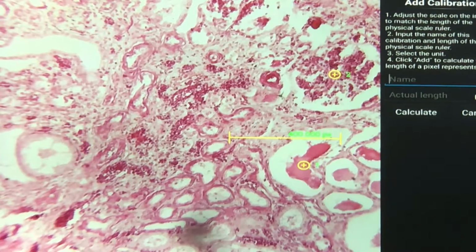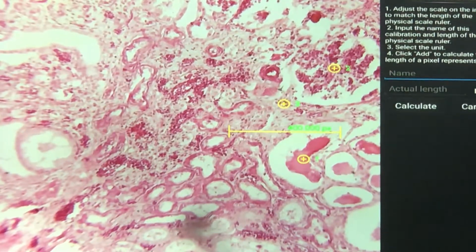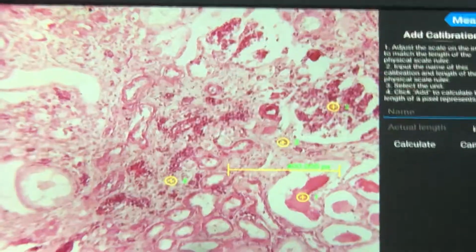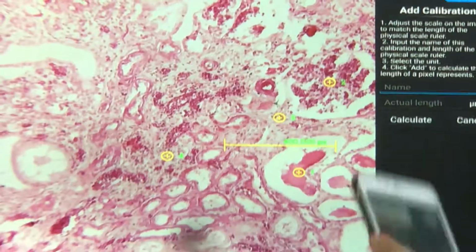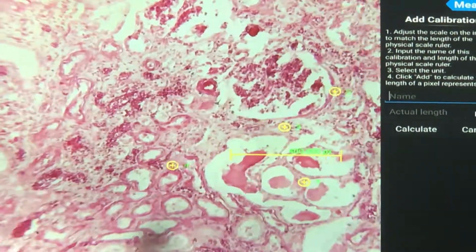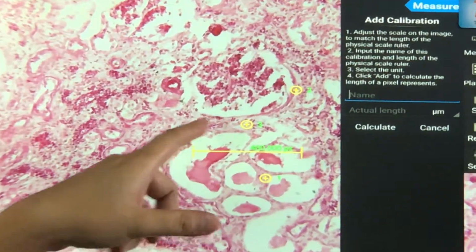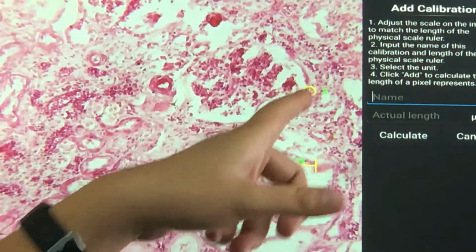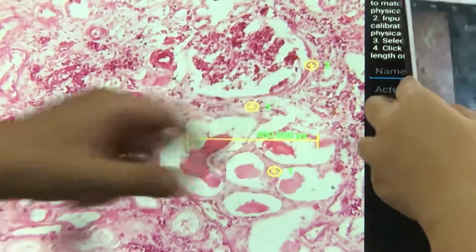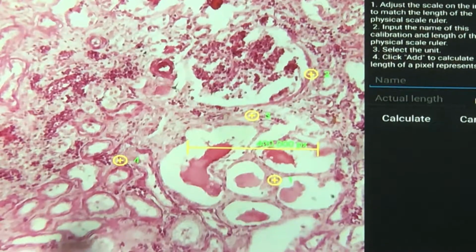How would you tell if this is chronic pyelonephritis? You see those infiltrates here, those little blue dots, those were lymphoplasmacytic cells. And where is the periglomerular fibrosis? The periglomerular fibrosis, I pointed on pointer number 2. This is just a review of your chronic pyelonephritis slide, so no need to elaborate. The most common organism, number 1 etiologic agent, is Escherichia coli.